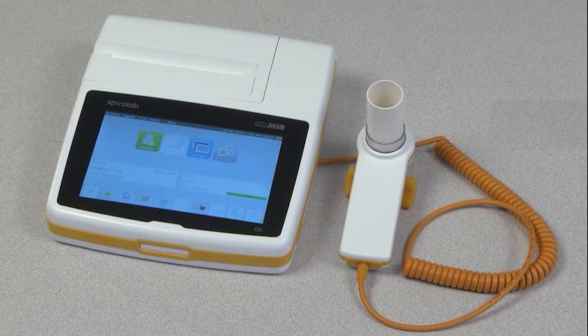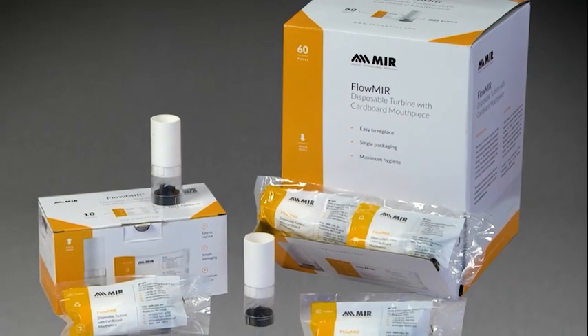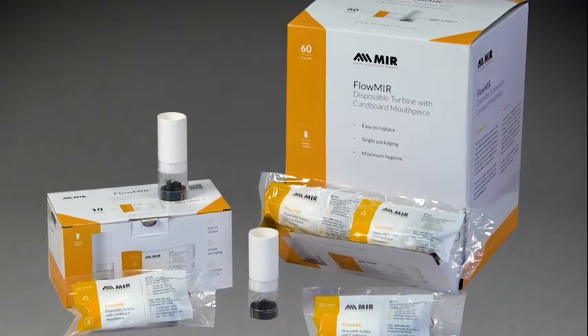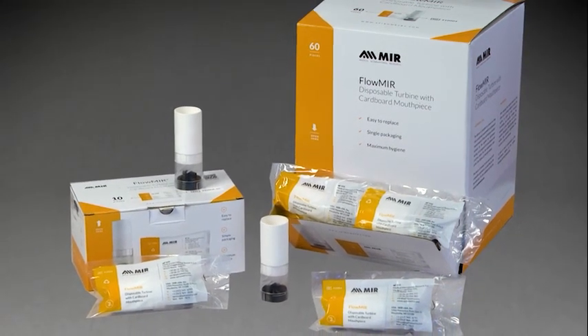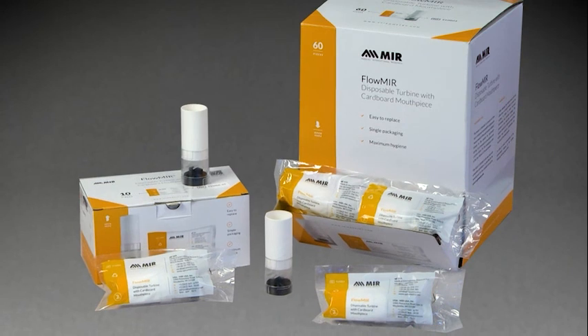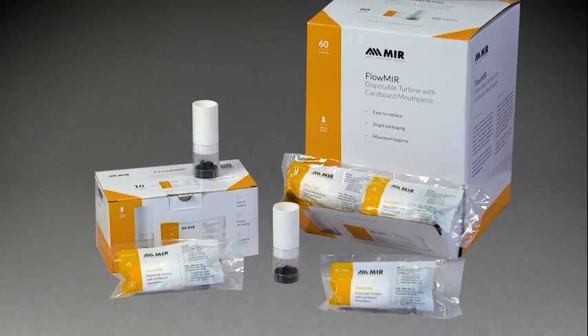Like all MIR spirometry devices, the SpiroLab uses the patented FlowMir disposable turbine with cardboard mouthpiece. Each FlowMir comes individually wrapped and pre-calibrated. Because the FlowMir is a closed system, there is no need to worry about cross-contamination or the need for expensive filters. After each patient, simply throw it away and open a new one.